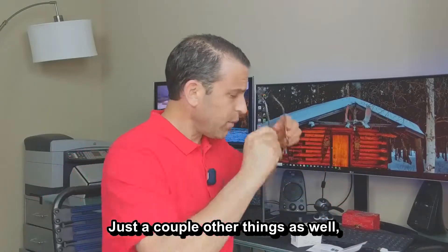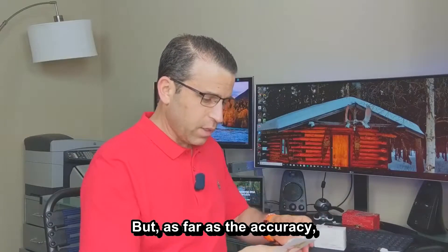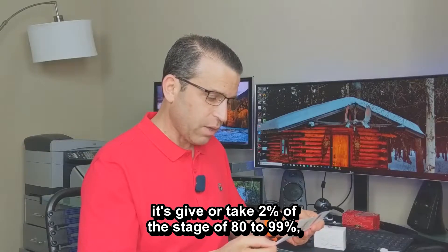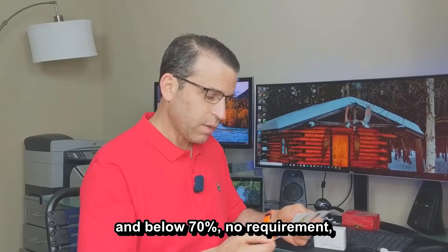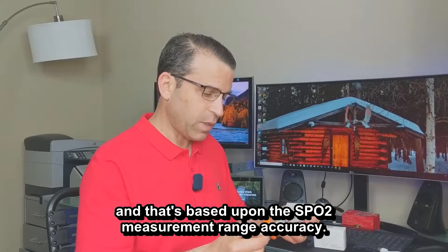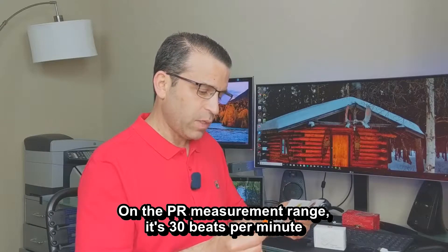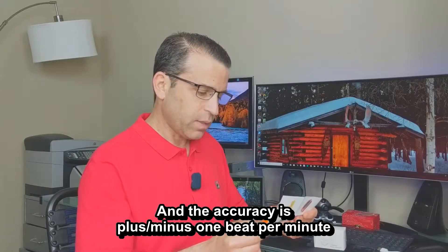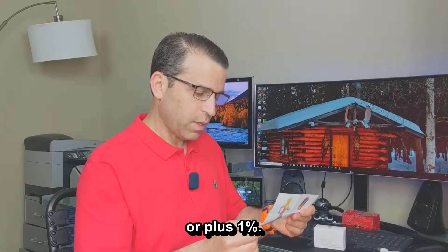As far as accuracy goes: for the SPO2 measurement range, it's plus or minus 2 percent in the 80 to 99 percent range, and plus or minus the same in the 70 to 79 percent range; below 70 percent there's no requirement. On the PR measurement range, it covers 30 to 240 beats per minute, with an accuracy of plus or minus one beat per minute or plus 1 percent.